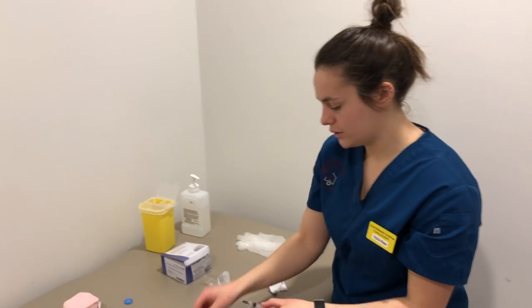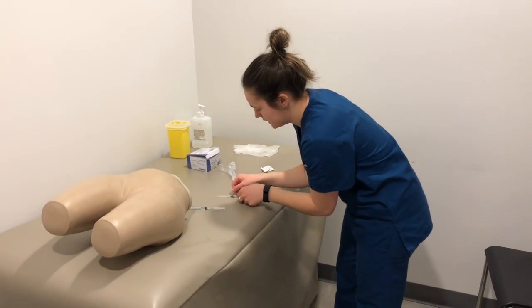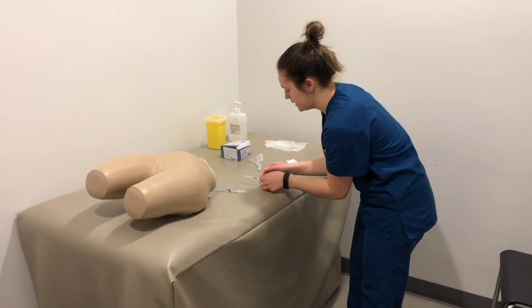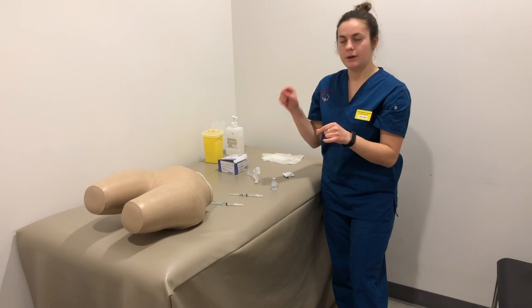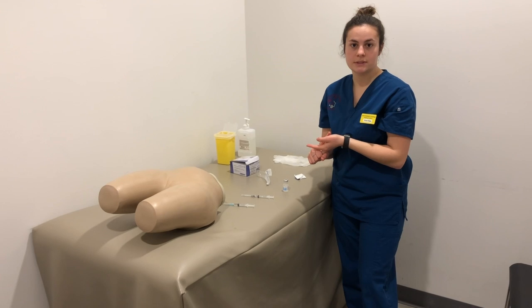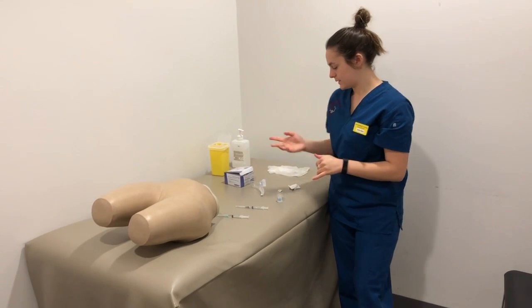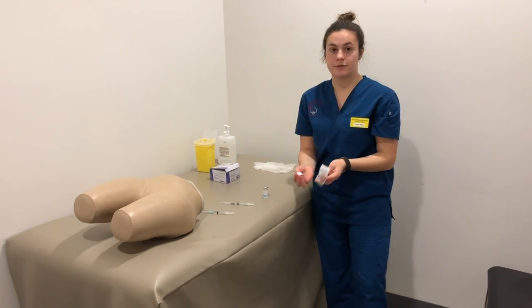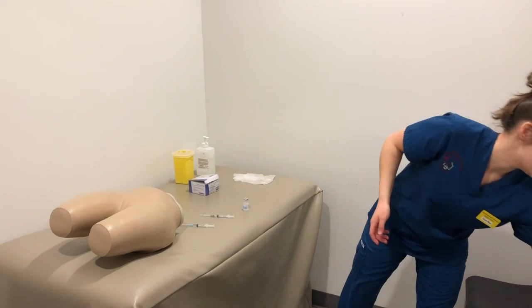So next I'm going to apply the sheath in a safe manner using the one-handed technique so that I don't stab myself by accident. And I will be applying the label to this one, again, Haldol, 0.5 milliliters, and the patient's name, Mario Mancini. Next I'm just going to, again, dispose of the garbage in the appropriate receptacle. It's not sharp, so it's just going to go in the garbage.